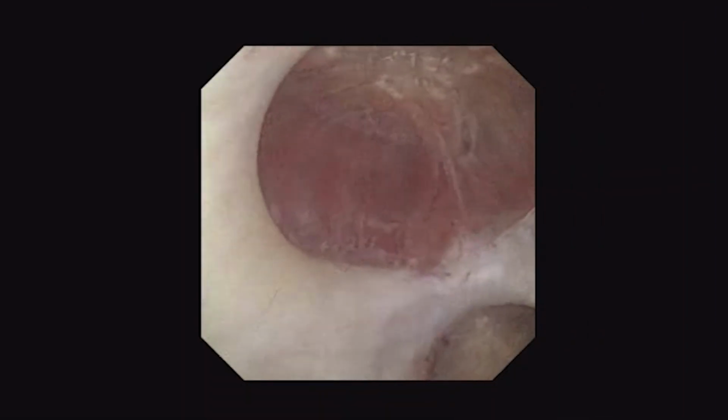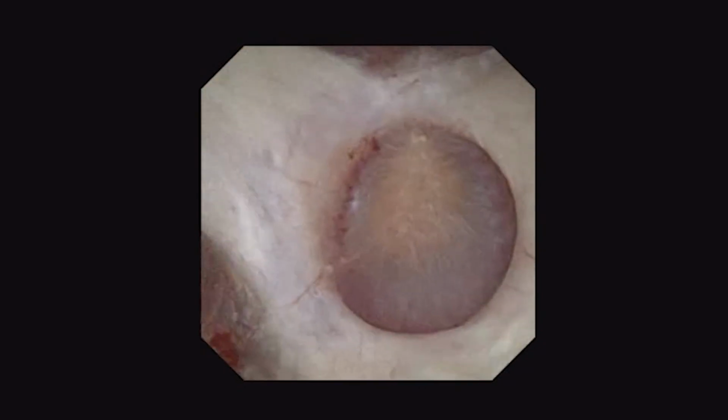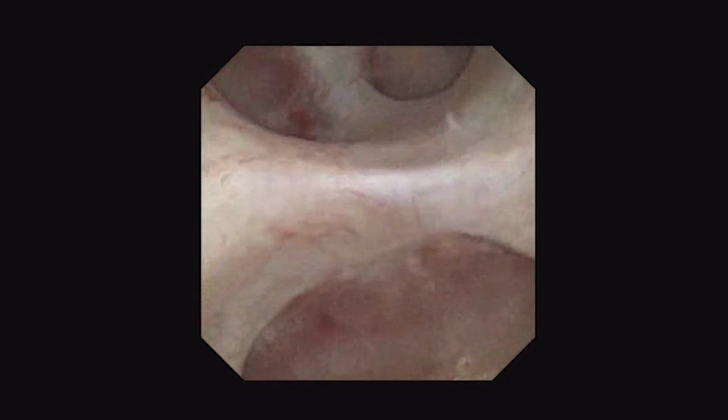I think we're just starting to make sense and scratch the surface of what we're seeing inside the kidney. And one of the biggest limitations is that we all can tell normal from abnormal, but coming up with a way to describe those abnormalities is very challenging. So we need a system to make sense of what we're seeing.